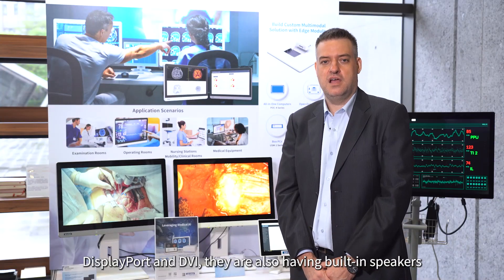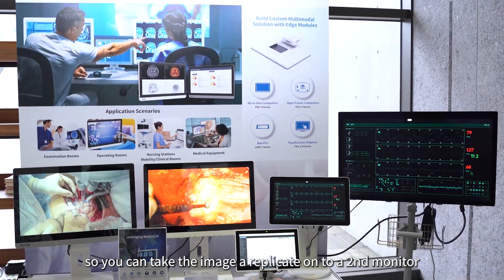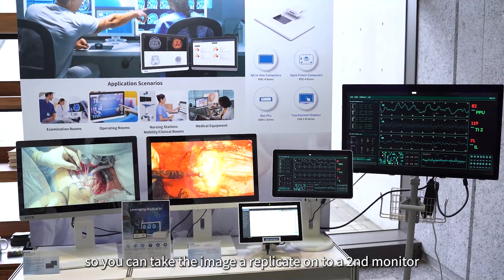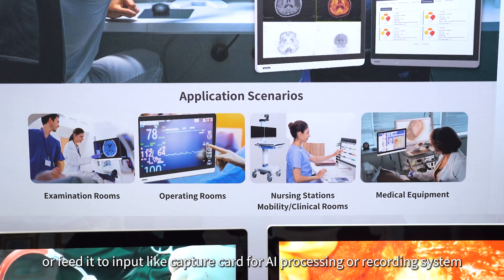They also have built-in speakers, and in fact the HDMI has a loop out function so you can take an image to replicate onto a second monitor, or feed into an input like a capture card for AI processing or recording system.